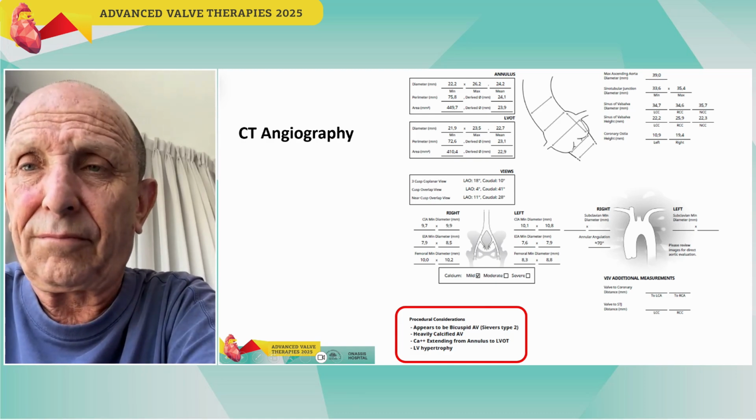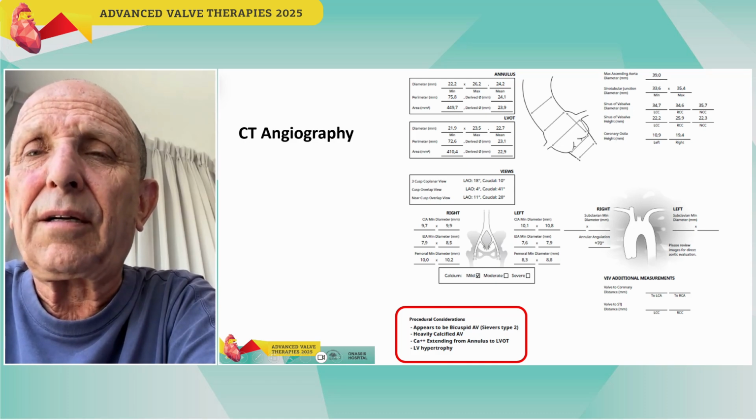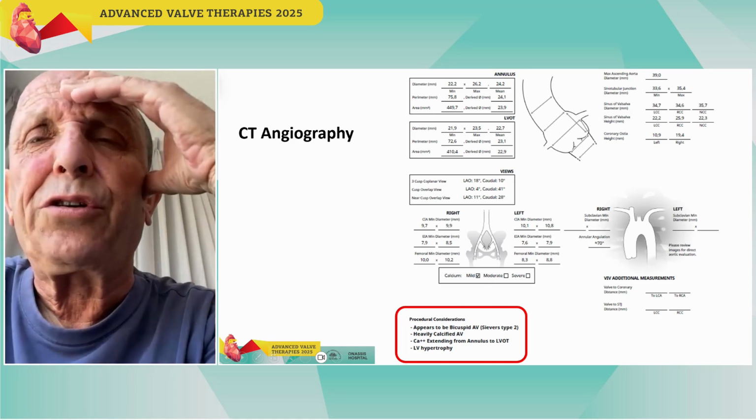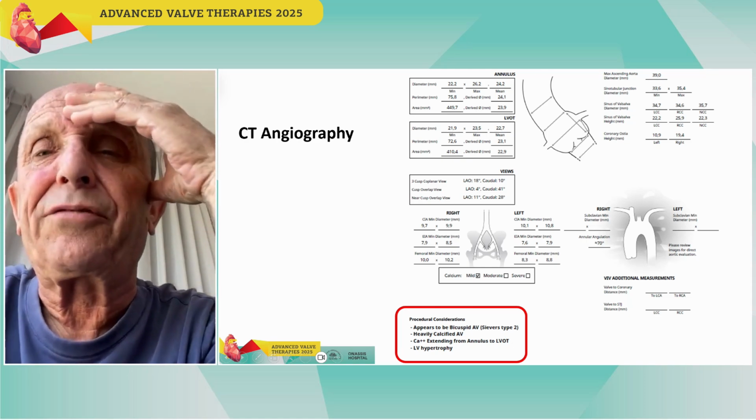So would go a little above. It's 22.2, the minimum diameter of the annulus. So Eric would round it up to 23 and use a minimum annulus diameter. What did you use? He started with 20. Okay, so I would try 23.